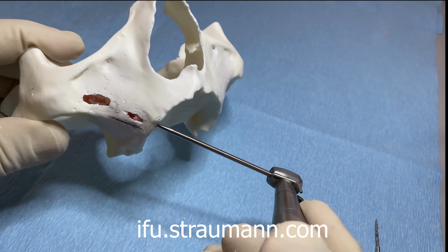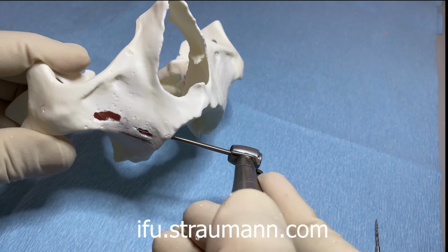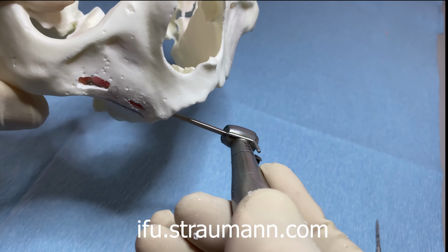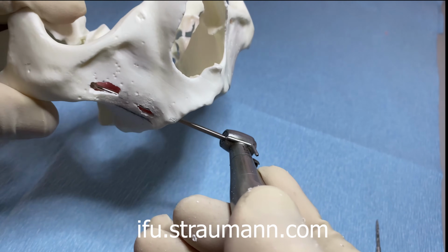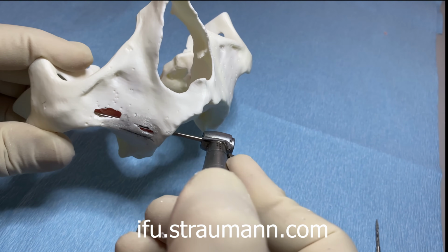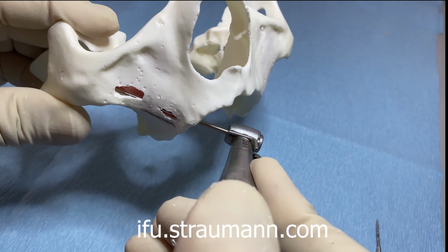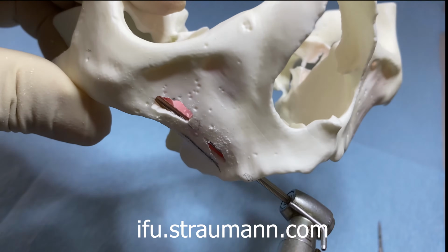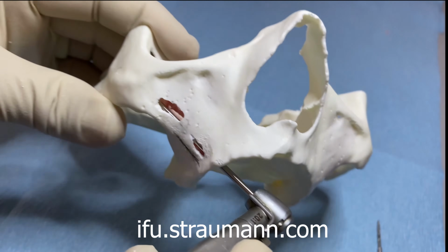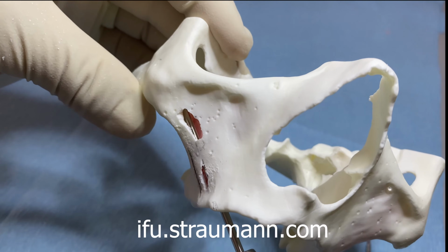At this point, I introduce my round drill, and I try to stay within the sinus here, keeping as much of the lateral wall as I can. You can see the shaft of my drill is butt up against the posterior wall of my sinus opening, parallel to the black dotted line, if you will. And I enter the base of the zygoma, and I'm making a small indentation so that my 2.9 millimeter drill can seat. And again, the drill is butt up against the lateral sinus wall and going up towards the frontozygomatic notch, nowhere close to the orbit, as you can see.